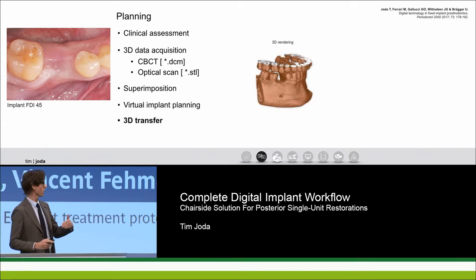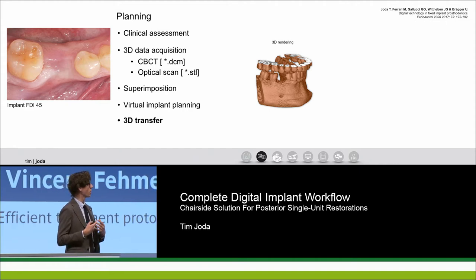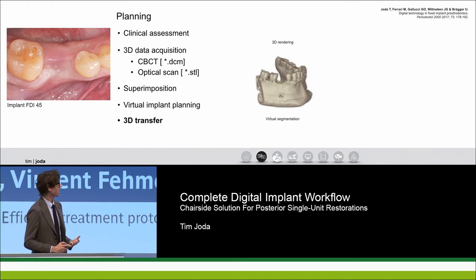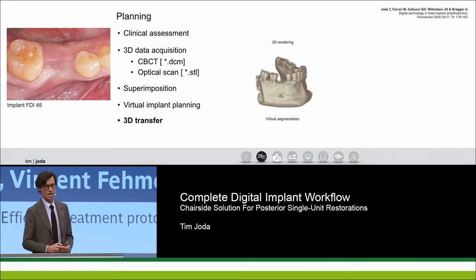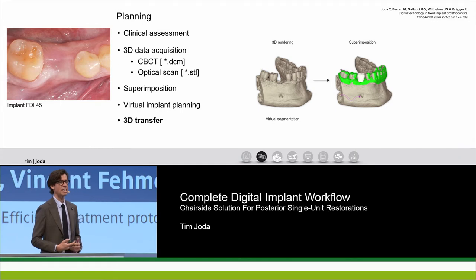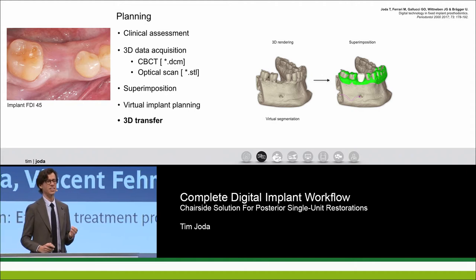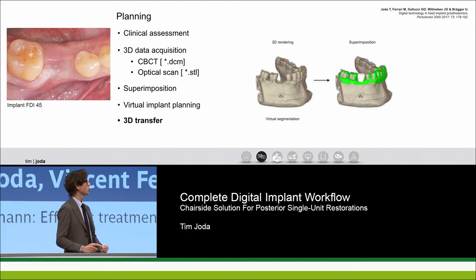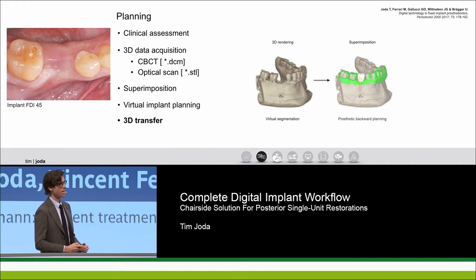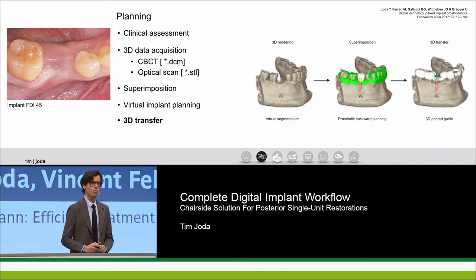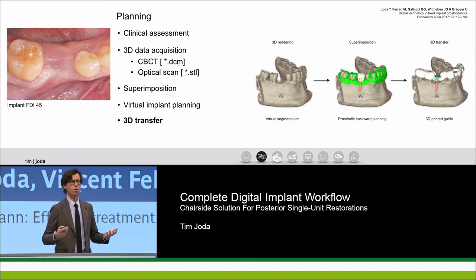Here are the steps roughly — Gary will show these in more detail as a surgeon later. We start with the 3D rendering of the cone beam CT, segment and isolate the relevant area — the mandible in this case — then superimpose the scans. The tooth shown doesn't represent the final restoration; it's just for planning, interacting with the dental technician, surgeon, and prosthodontic team in a seamless flow. Then we place the implant in the correct 3D position and can visualize the abutment structure. We then transfer this to a virtual surgical guide, which is printed or milled.